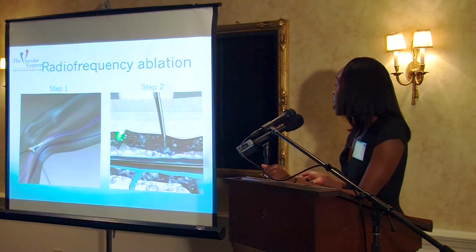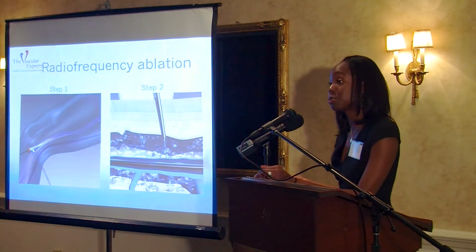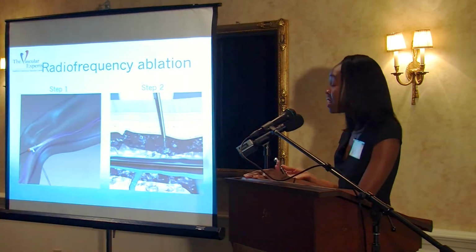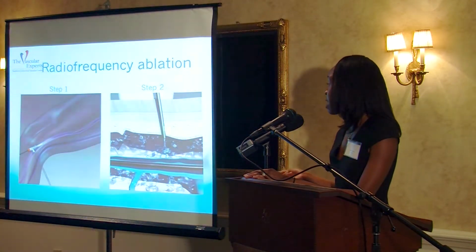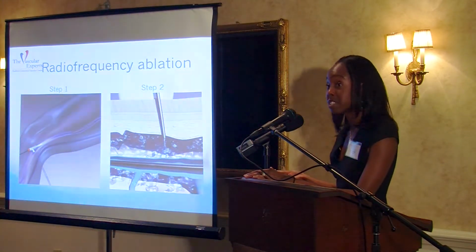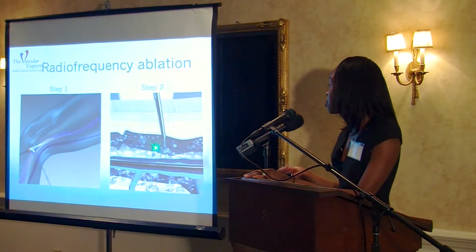The next step, which any patient who has had this procedure can tell you, and any interventionalist who has performed this procedure can tell you, is the most uncomfortable part of the procedure. This is the application of the tumescence. Under ultrasound guidance, we are infiltrating via a needle a solution of lidocaine and bicarbonate to hopefully make that more comfortable for the patient, all along the catheter, all along the vein that is to be treated.